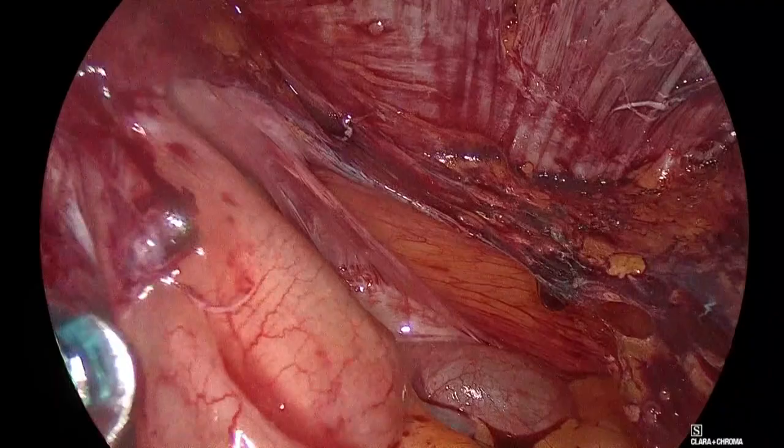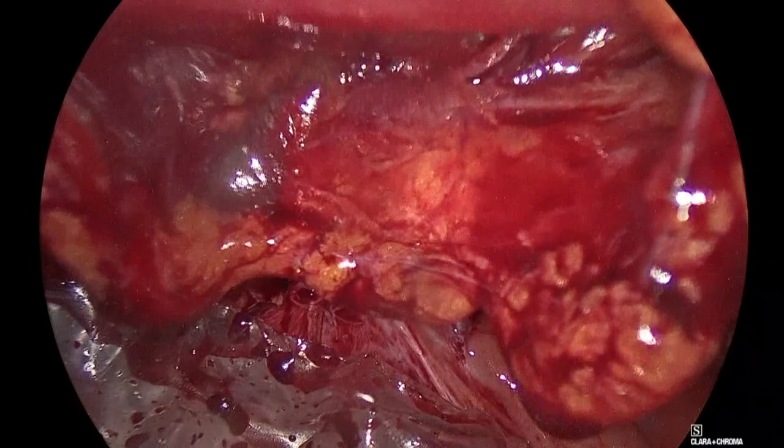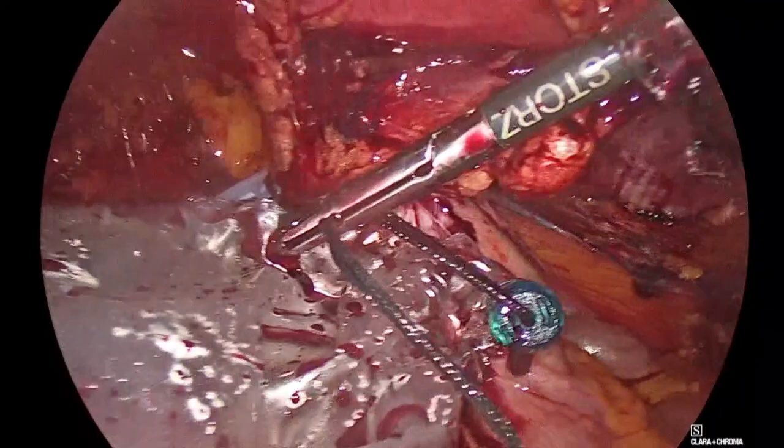Panagiotis, take out your trocar. This is how we always check the trocar. If there's any bleeding, look at the vessels. You see the vessel? The crossing vessel. So the way we do this, by pushing the grasper from the inside out, very rarely damages vessels. But look at this opening in the peritoneum. I don't think we should do a mesh reconstruction. So what we do now, we just pull the bag here and we're done.